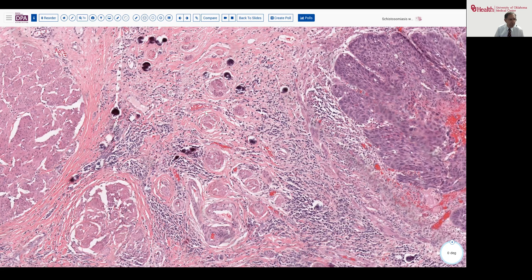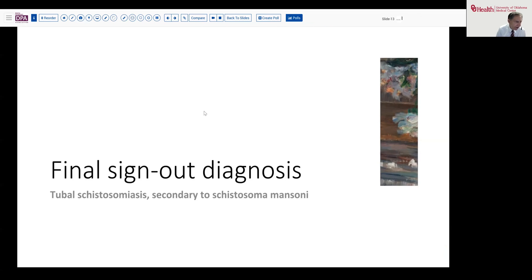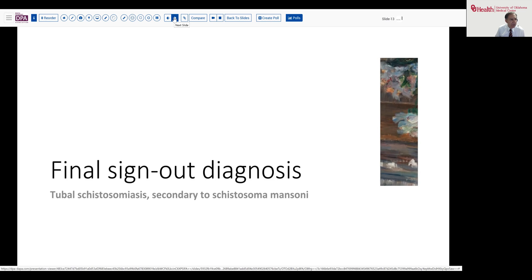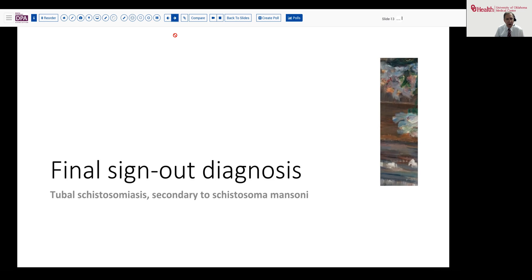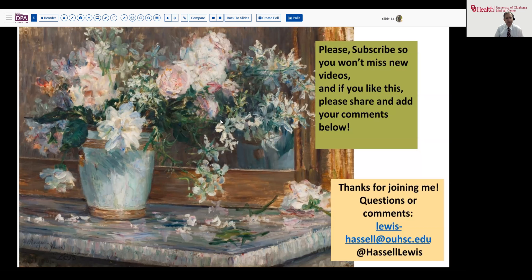That brings us to the end of this quick summary. Our diagnosis is tubal schistosomiasis, in this case most likely secondary to Schistosoma mansoni. We did see a little bit of a lateral hook on some of those eggs. I hope you enjoyed this quick run-through on schistosomiasis. It's fortunately not a highly prevalent disease in much of the world where many of us work.